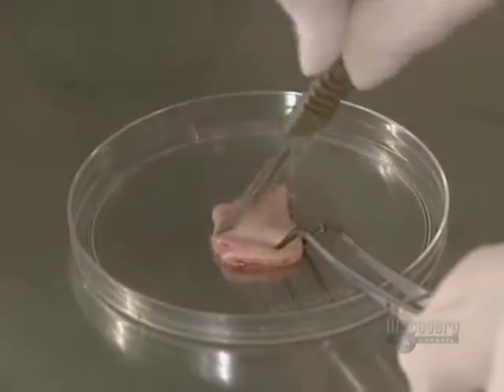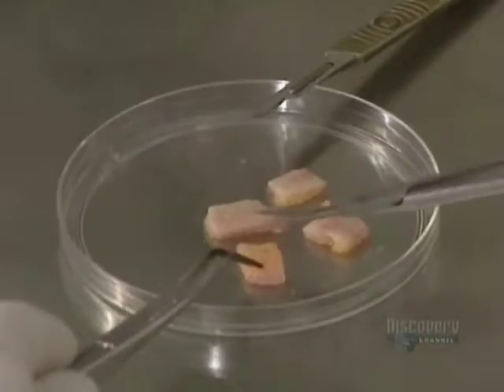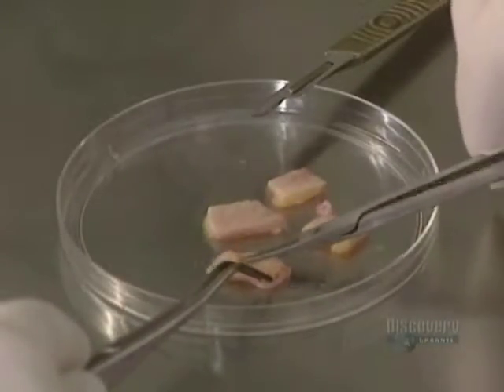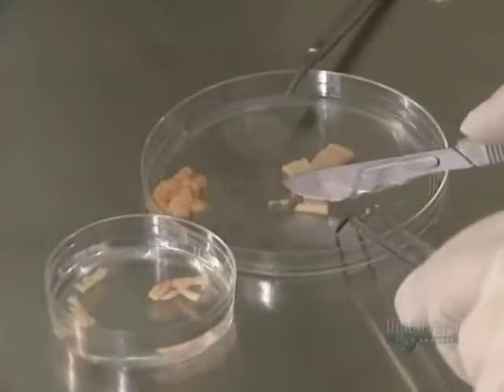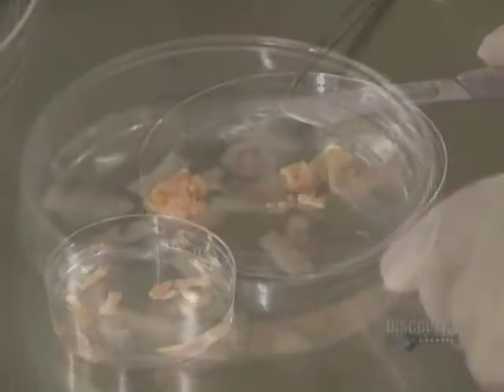A piece of skin is cut and delicately sectioned on a petri dish with a scalpel. The fat is gently detached from the dermis since it will not be needed in the culturing. The skin is cut into thin strips because thermolysin, the enzyme which separates the dermis from the epidermis, acts more efficiently on small surfaces.